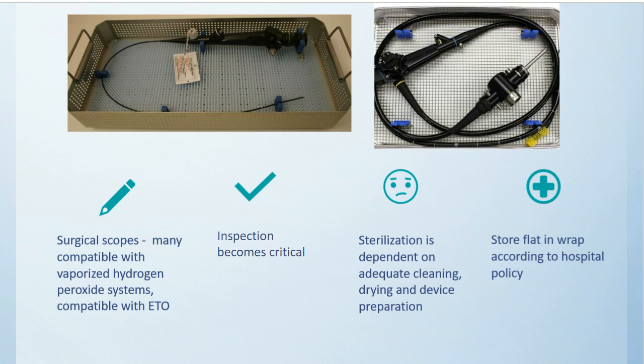Why aren't they being sterilized when you have that available in Central Sterile Services, or SPD? And I know we don't like to lose control of our inventory, but sometimes that's necessary. If you are moving to sterilization, we absolutely have to inspect those during the processing cycle and also, again, in the procedure room before they're used per the IFU.